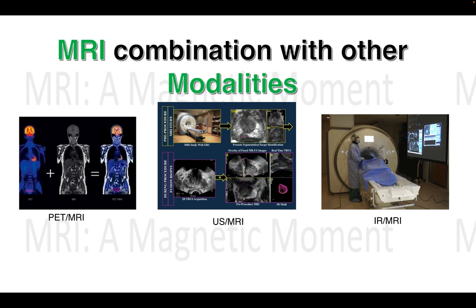So this capability of the PET MRI combination makes it ideal for staging of tumors and pre-surgical planning in our cancer patients. So very useful.